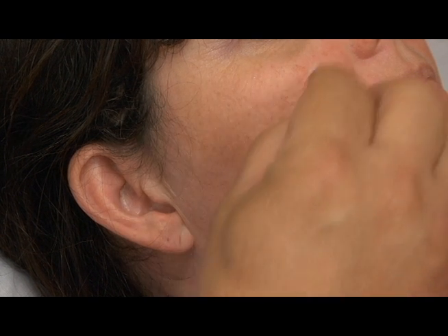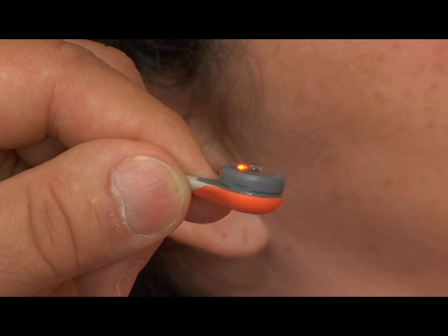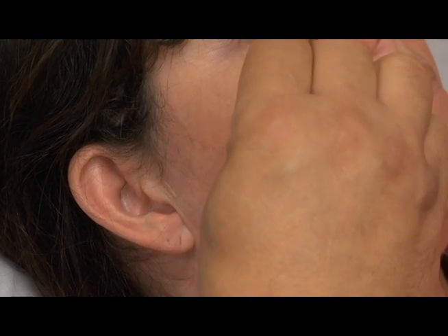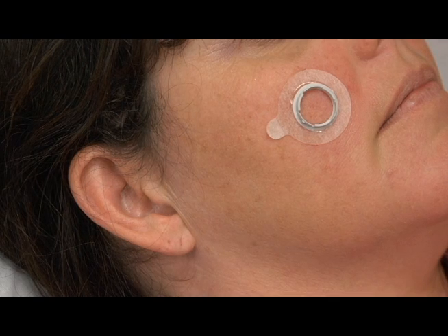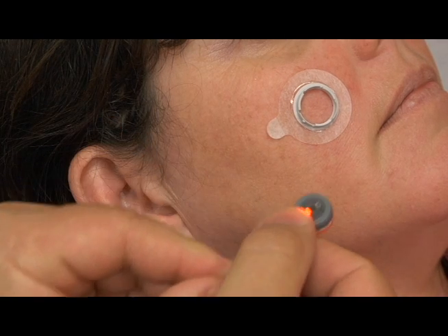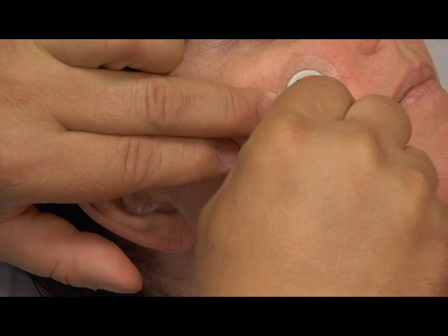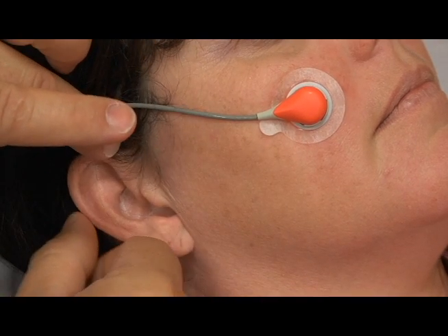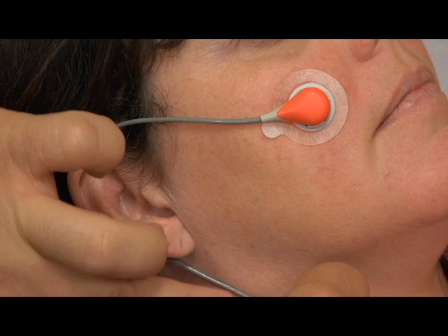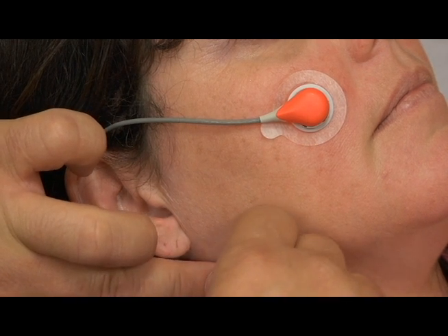Multi-Site Attachment Rings: Clean the skin with alcohol where the multi-site ring is to be used. Reapply one small drop of Centec contact gel or water to the sensor membrane. Remove the cover of the adhesive tape of the attachment ring and attach the ring to the measuring site. Move your finger around the ring circumference to ensure good adhesion of the entire adhesive to the skin. Holding the sensor at the cable strain relief, approach the ring from the flap side and first insert the nose of the sensor into the ring. Then apply a slight downward pressure on the cable strain relief. The spring tension of the application device will pull the sensor into place with little to no pressure on the skin. Slightly twist the sensor in the ring and press gently to ensure distribution of the contact liquid and contact with the skin.